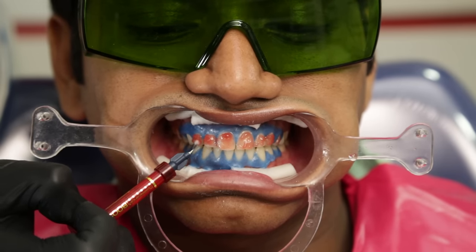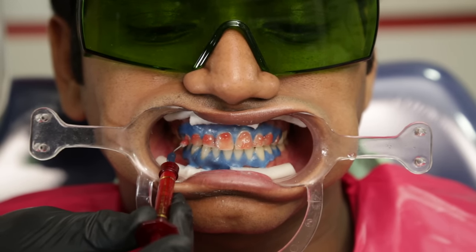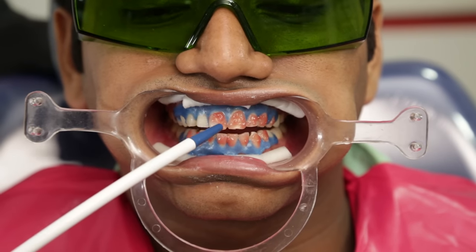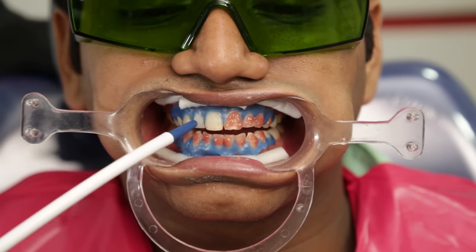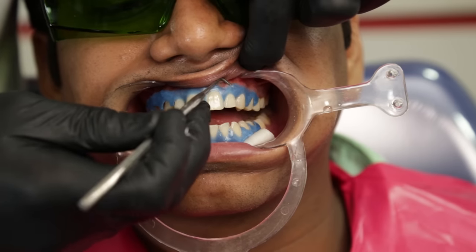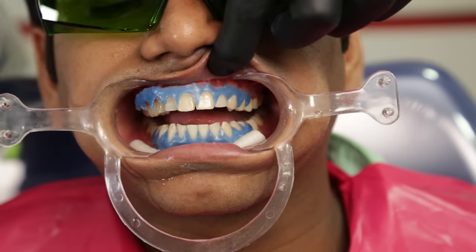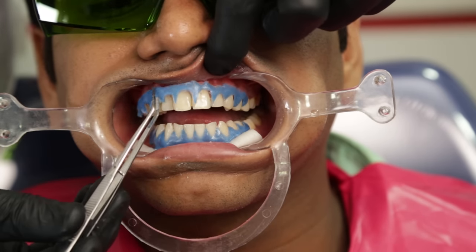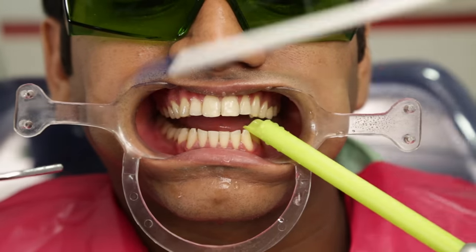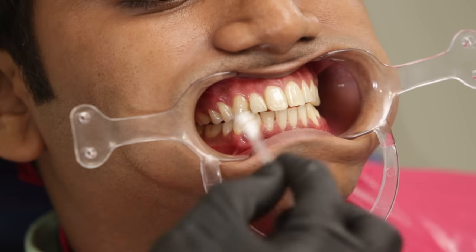In this case I am going to repeat the application of the bleach one more time, but care should be taken that not more than three applications at a single sitting should be applied. After around 15 minutes again, we suction the bleach and then use the water spray to rinse the teeth, using high-volume suction simultaneously. Once we have achieved the desired result, we take an instrument to remove the gingival barrier — it's usually very easy to remove and may come out in one or more pieces. In case I see any gingival burns, I can apply some vitamin E gel to promote healing.